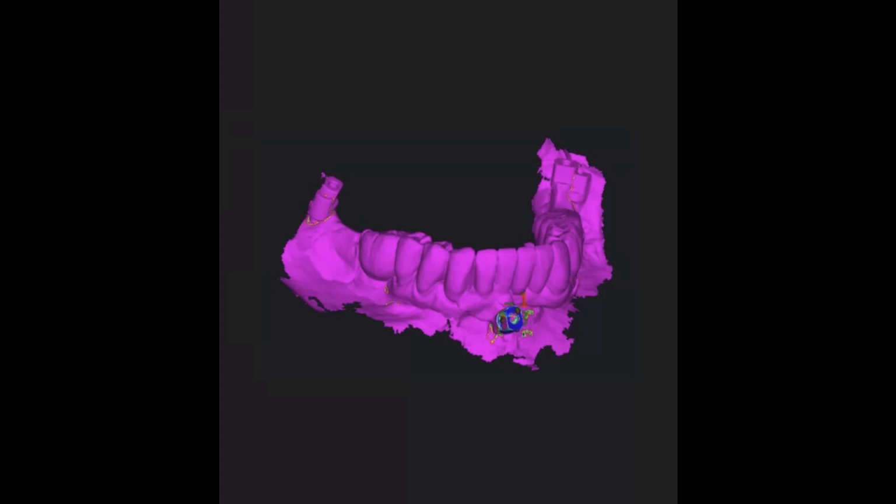This is, I would say, the initial way that this was taught and the way that a lot of people are still doing it, to put fiducial markers in the mandibular posterior. And you can see right away that we have alignment problems and that you cannot align the posterior mandible right with the posterior mandible left with the midline all in one fell swoop. So let me get into this without any further ado. Let me change screen. I'll tell you a little bit about the history of this.